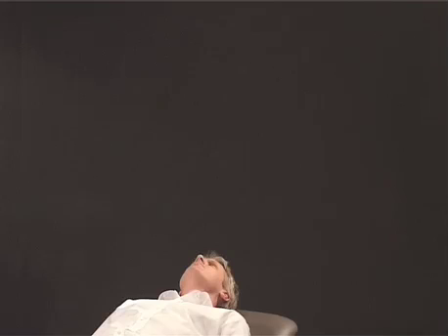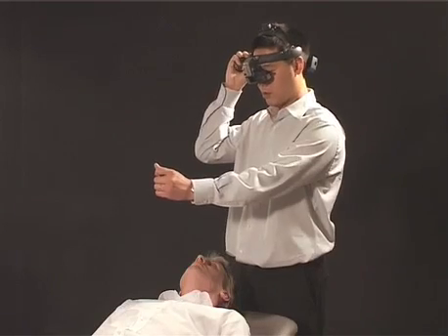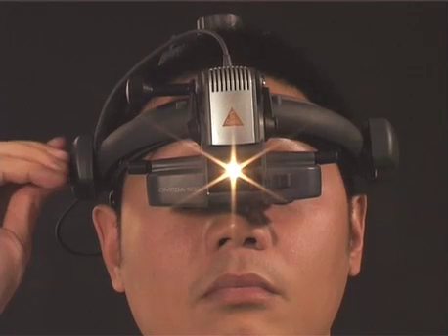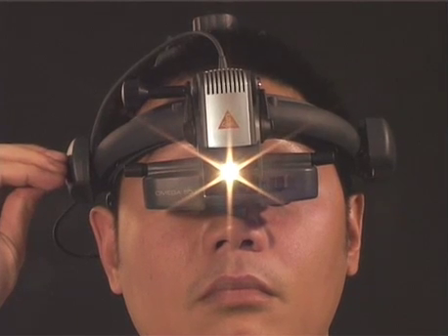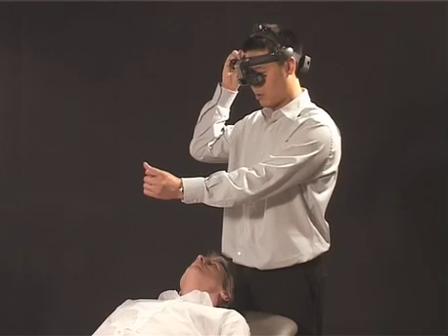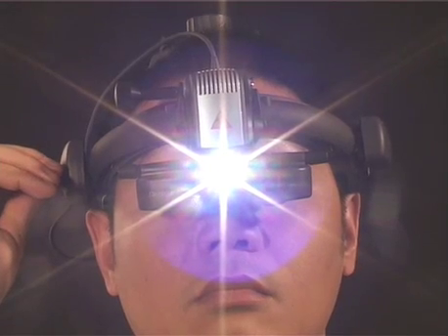With the patient suitably prepared, you're now ready to proceed with the systematic examination of the retina. Begin with the illumination at quite a low level. The lower intensity will reduce patient discomfort and allow the retina to adapt. You can steadily increase the brightness as the patient becomes more accustomed to the light.